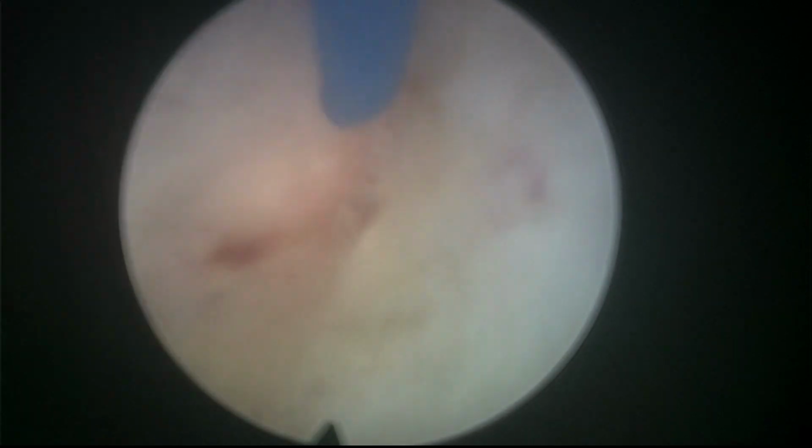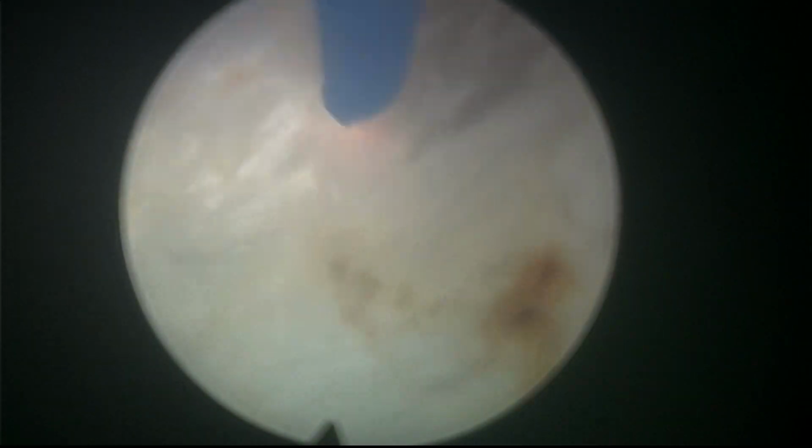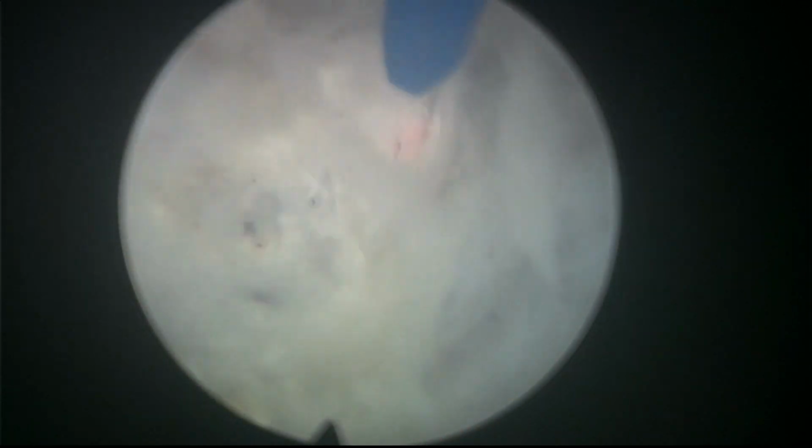That cuts the attachments of the adenoma with the capsule, but the energy is not going towards the capsule, so the risk of perforating is very low. And my bet is, when you have to move everything, your chances of pointing or targeting your laser correctly are a little bit less, maybe.